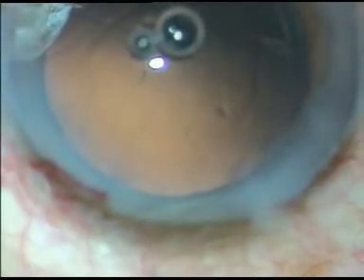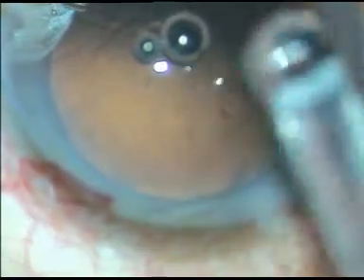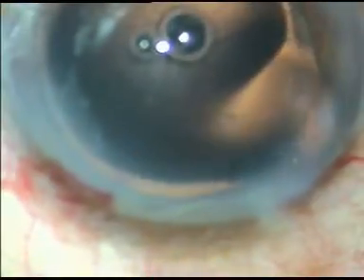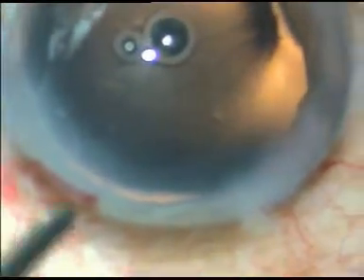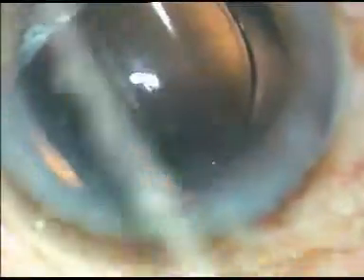After polishing the posterior capsule, I implant the IOL. I don't give viscoelastic. The lens is implanted under irrigation. This is a hydrophilic acrylic IOL and it is going directly into the capsular bag. Now I position the lens so that the haptics are horizontal.